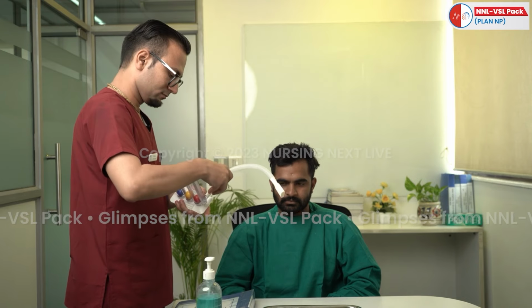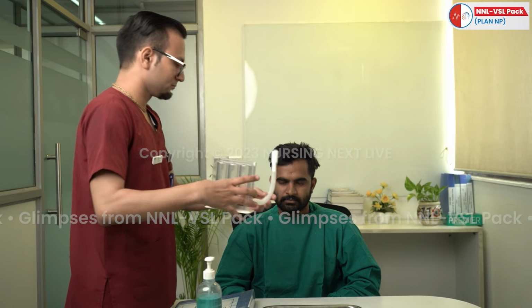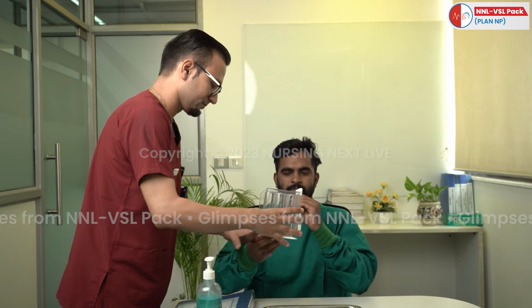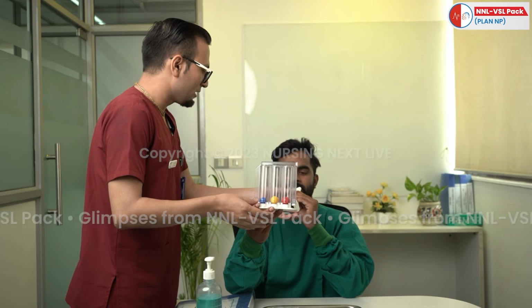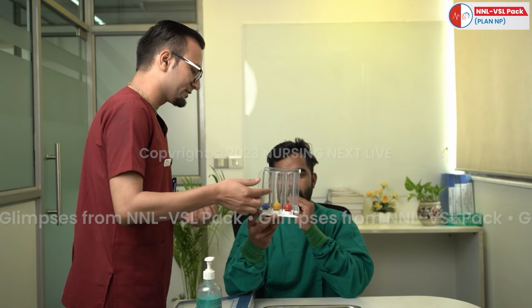The patient is instructed to hold the spirometer in an upright position, exhale normally, and then place the lips tightly around the mouthpiece. Sir, you have to hold the spirometer in an upright position, and now you have to place your lips tightly and you have to inhale slowly to raise the ball.